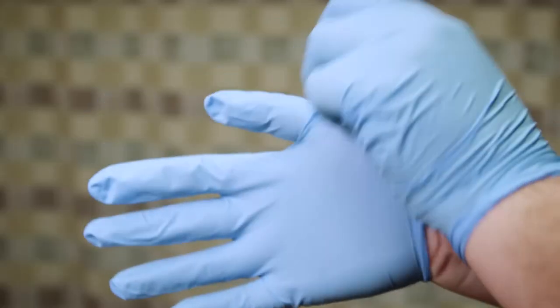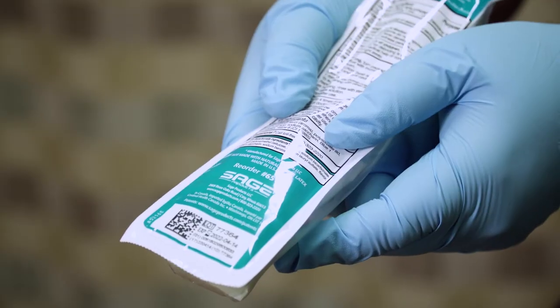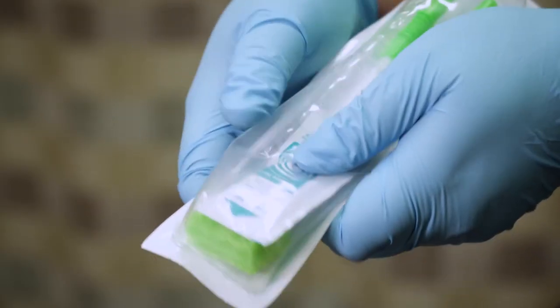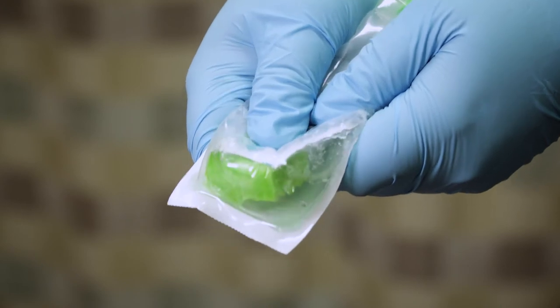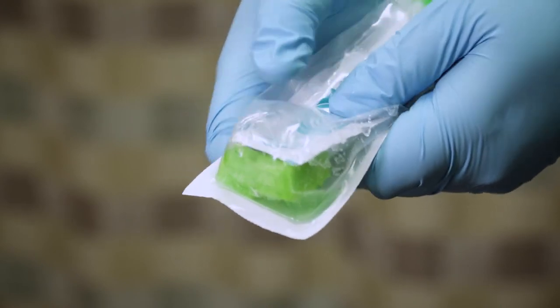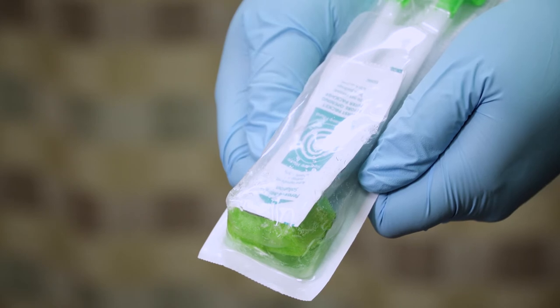Put on gloves before you begin. Before opening, turn the packet over and use your thumbs to burst the solution packet. This will release the oral solution and saturate the swab.